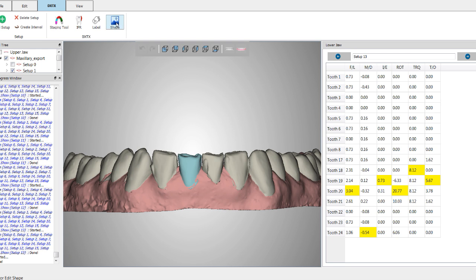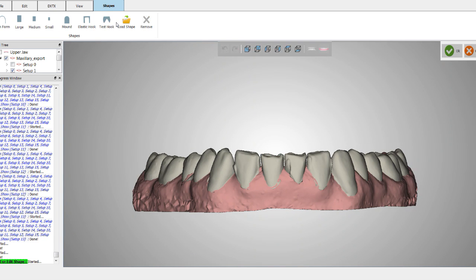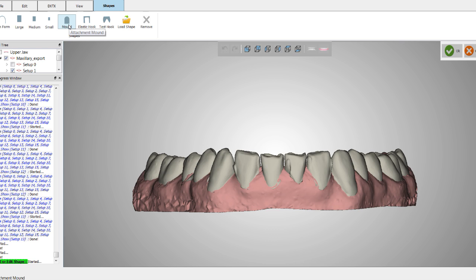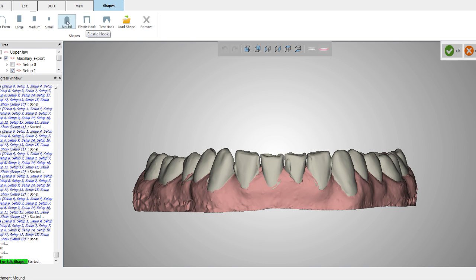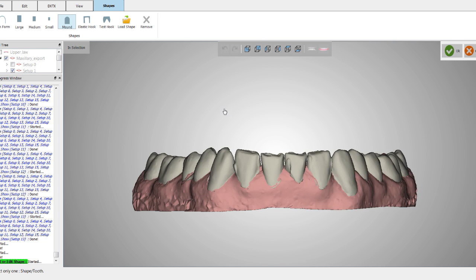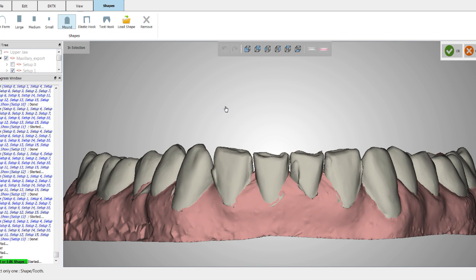We're now going to click on the shape tool. I like to use the mound shape. That's pretty much the only attachment that I use. It's very easy to place, very forgiving, very easy to use. You can obviously experiment with whatever you want, but in my hands, I've just found the mound to be very versatile.